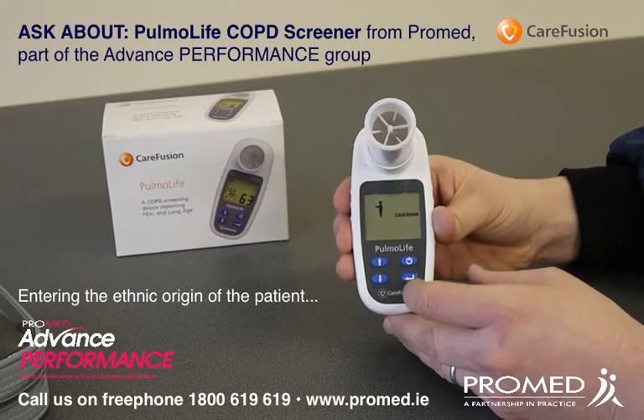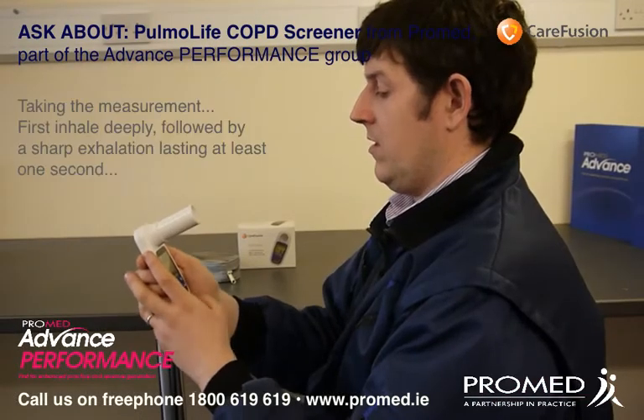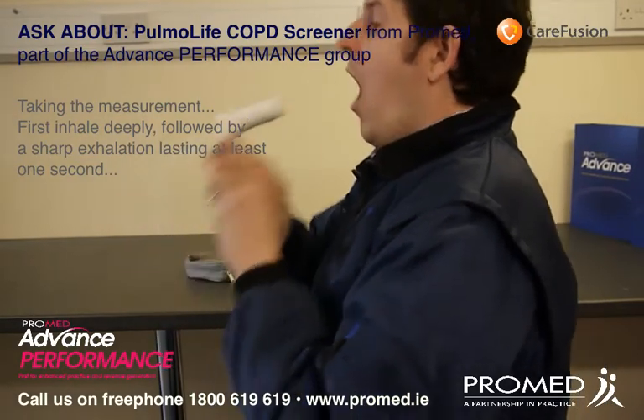The device is now ready for measurement. What we will first do is inhale deeply, followed by a sharp exhalation lasting at least one second.